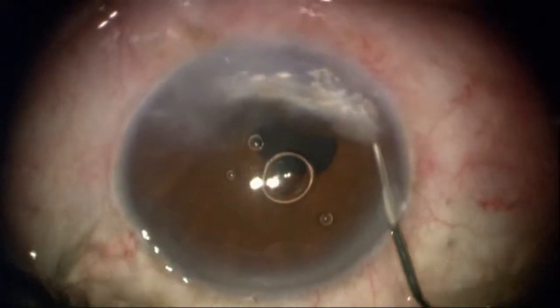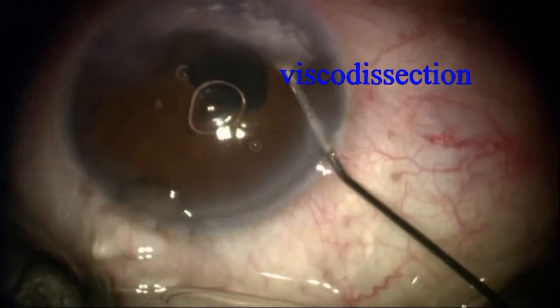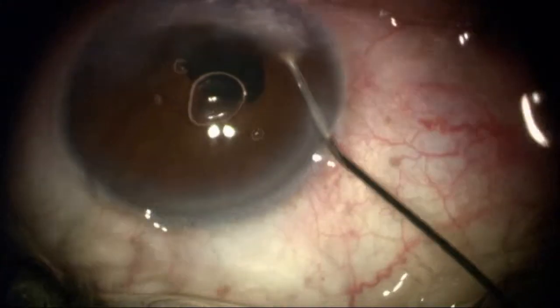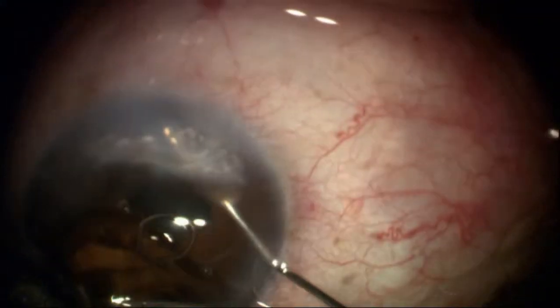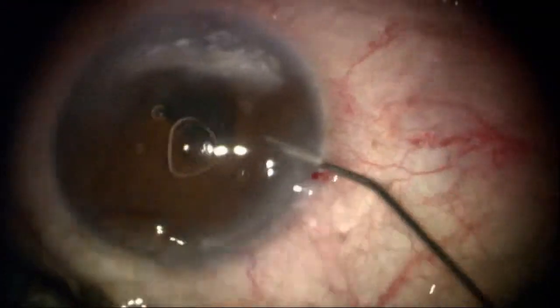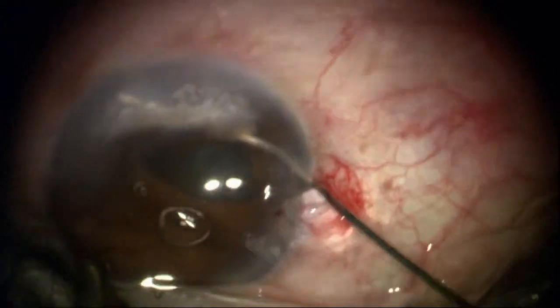I'm going to demonstrate three different types of synechia lysis here, starting initially with visco dissection, which is the most gentle, followed by blunt dissection and even a small amount of sharp dissection. Those are the three different techniques for getting the iris away from the cornea.